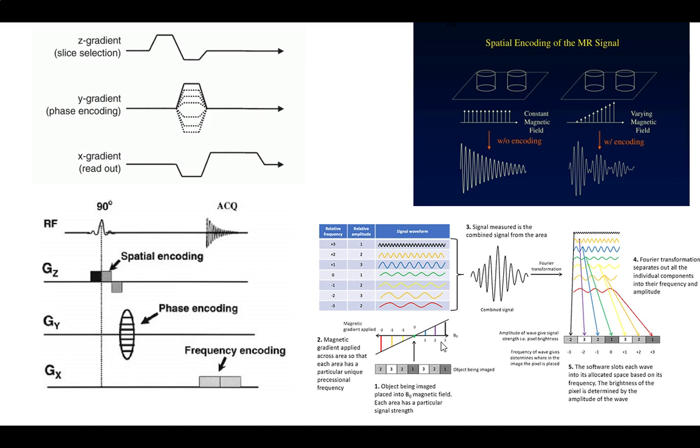My only thing was I just don't understand how the phase encoding determines anterior and posterior, because I was under the impression that phase was material specific and not spatially specific. So I'm changing that.